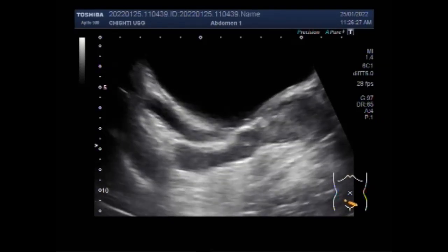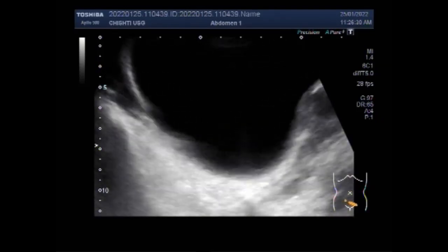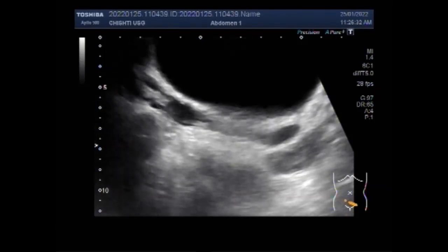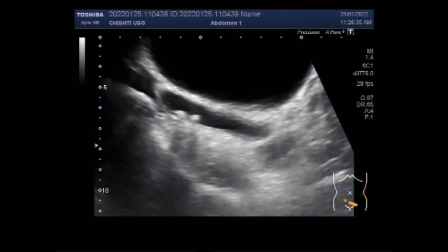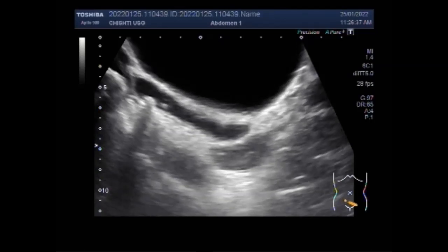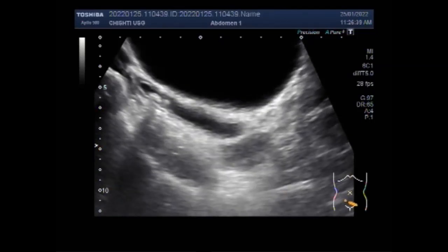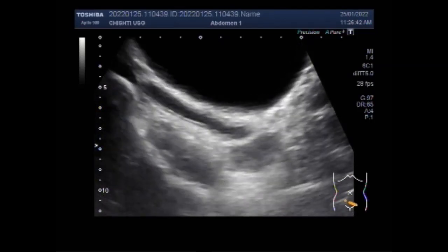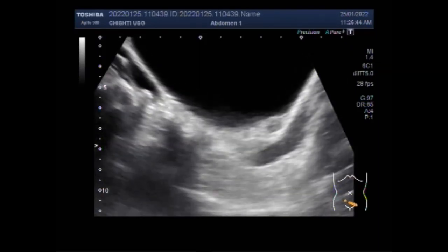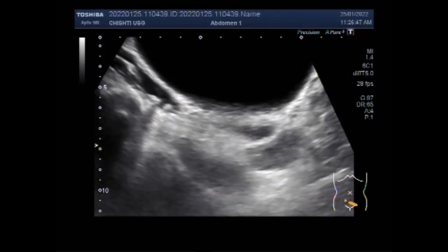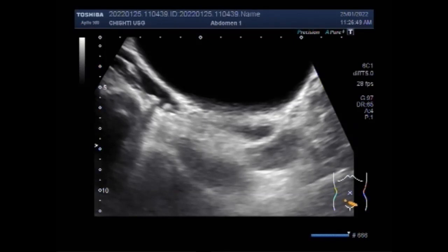Now you will see the interesting movements of the stones in the ureters. You can observe the movements of the ureteral stones as the amount of urine builds up. Some urine escapes through the stricture but again regurgitates backwards and the stones are pushed upwards towards the kidney.